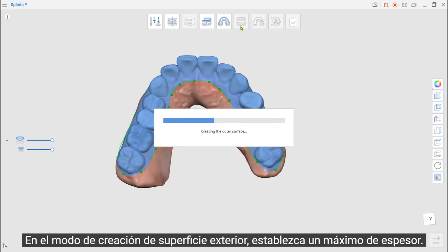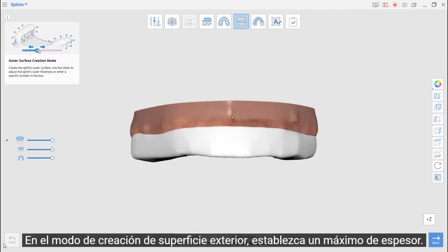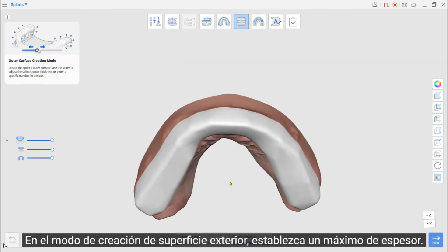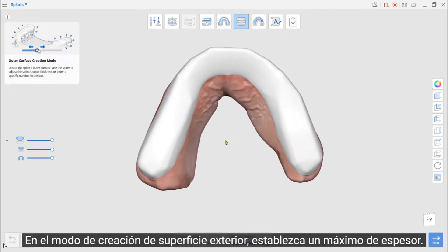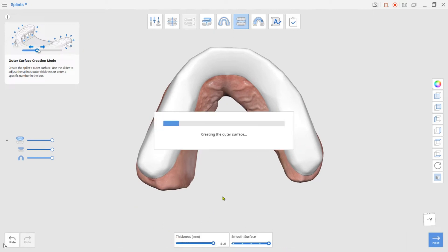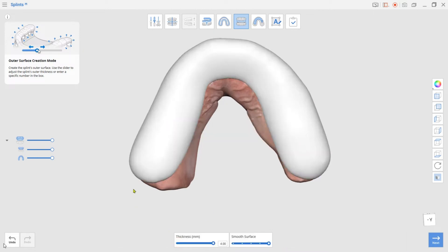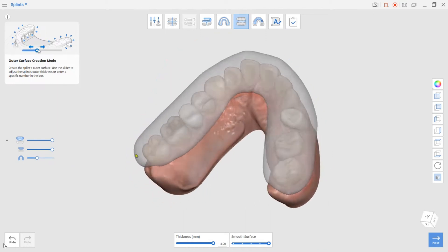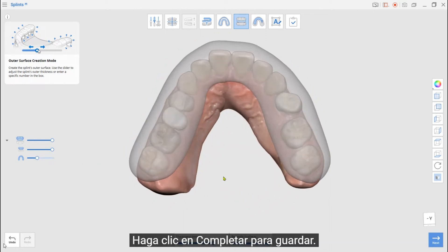Click Complete to save. At the Outer Surface Creation mode, set a Maximum on the Thickness. Click Complete to save.